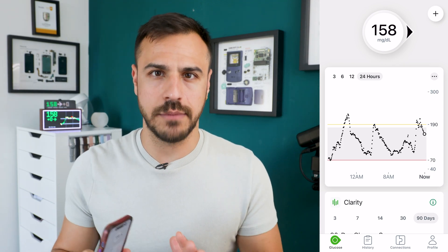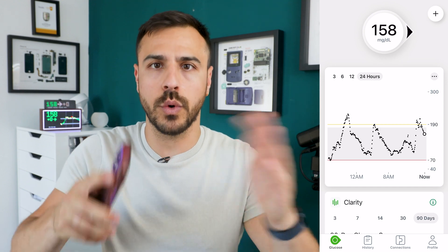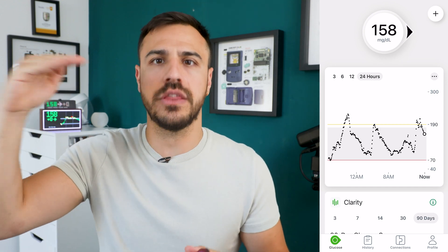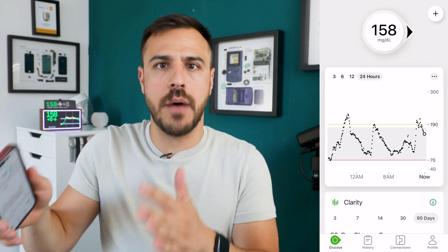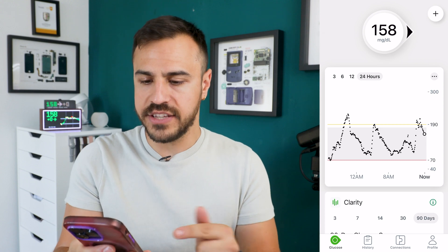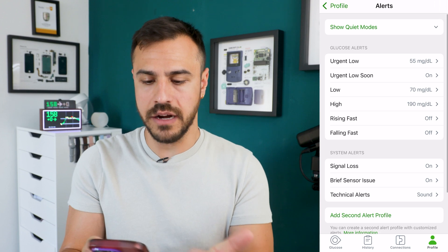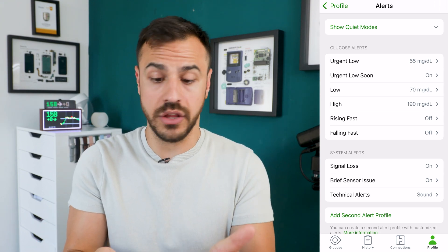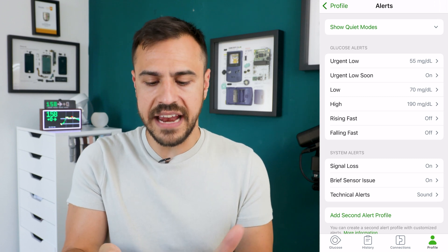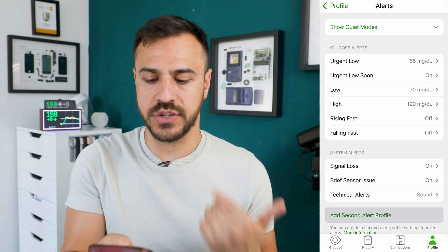One of my favorite things about Dexcom G7 is the ability to create multiple profiles for alerts. You can set different thresholds for certain times of day, certain days that come on at that time. To do this, go to the Profile tab, then go to Alerts. If you haven't set one up yet, you'll just have settings and quiet modes on top. Then if you go all the way to the bottom, there's 'Add second alert profile.'